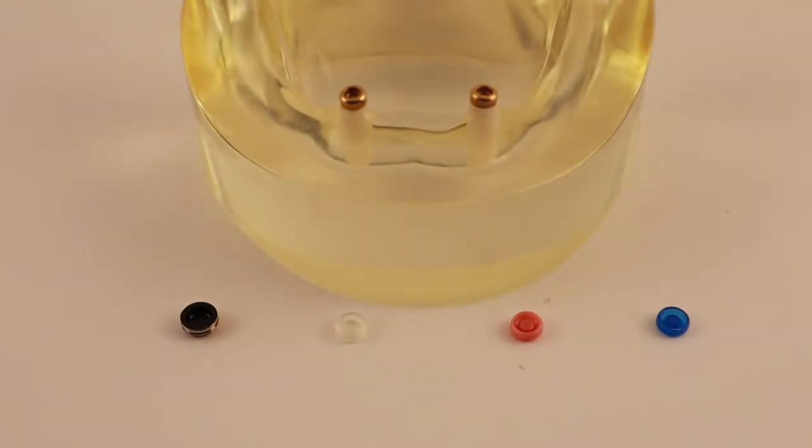That means the implants hold the denture in, but don't hold the denture up. Both snaps fit onto the same implant post, so they are interchangeable with a little bit of work.